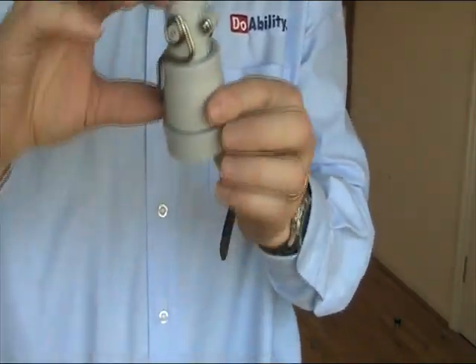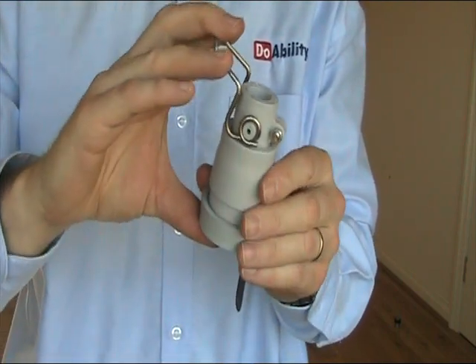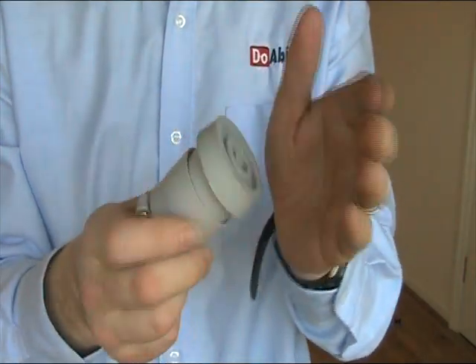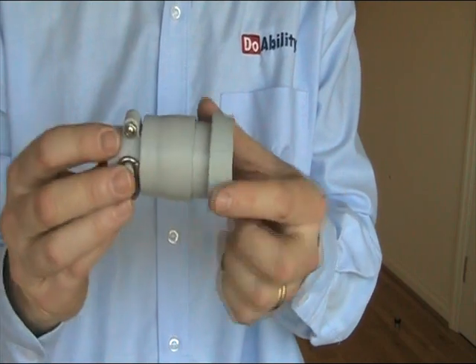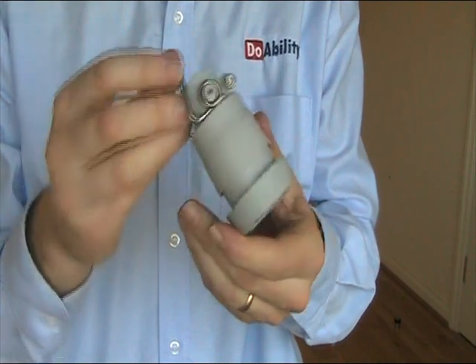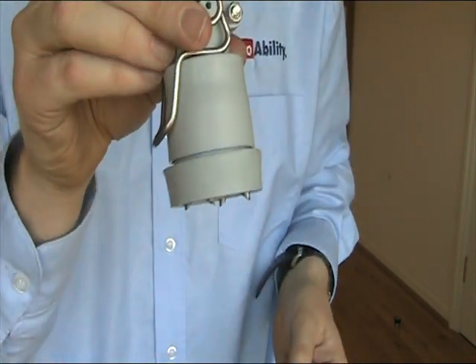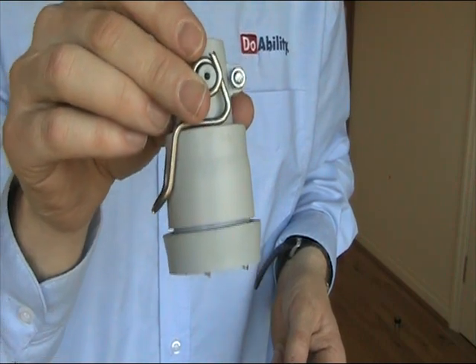How this works is there's a little lever here. You can either have this option for going on just normal concrete — it's just like a normal crutch or cane stop. When you're going over ice or snow, you just flick the lever down so that the spikes come out underneath to give you extra grip on snow and ice.